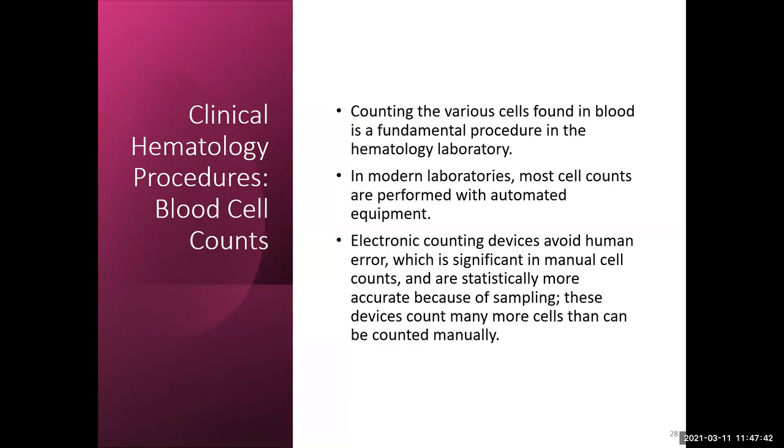And physicians sometimes, especially some of the ones who have been in practice for many years, like somebody to look at it. And you try to explain to them that this analyzer is counting thousands and thousands and thousands of cells. I'm looking at 100 cells. So which one do you think is more accurate in visualizing all of those cells? The analyzer looking at thousands or me looking at 100? So you will experience that in your career where you have physicians that don't believe the analyzer.